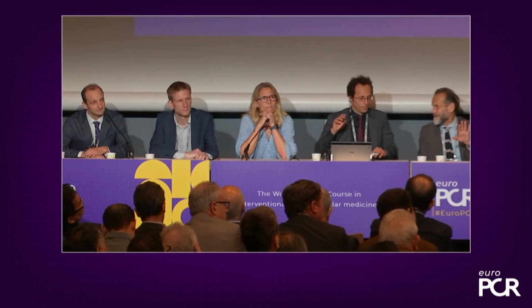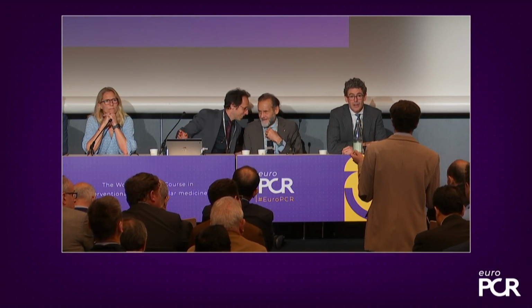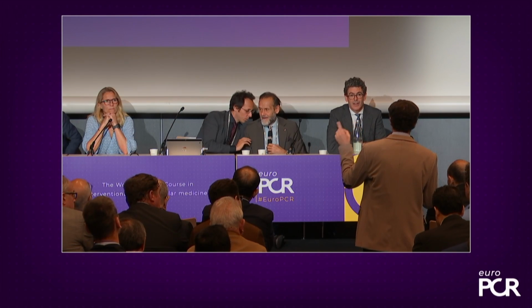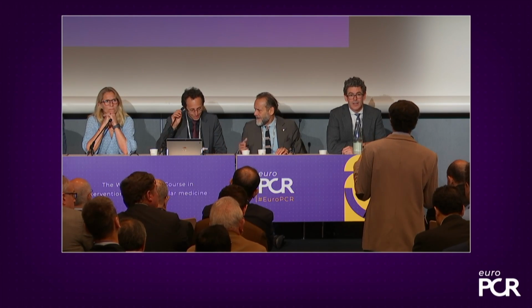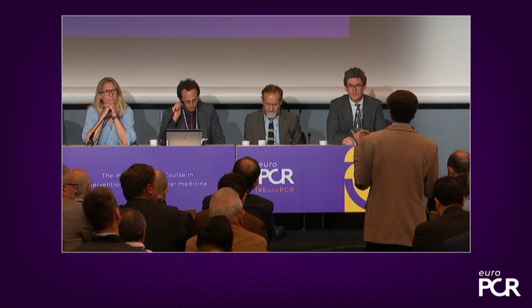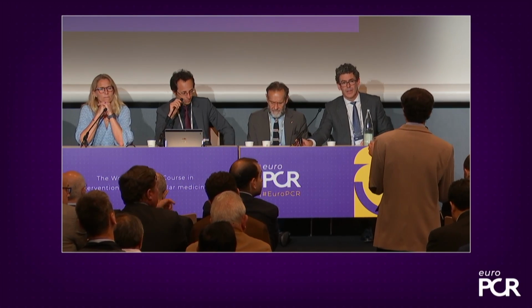Thank you. Great presentation, Dr. Jonathan. I have seen a similar case with a lesion in the ostial CX 1 year ago in the Netherlands. Full compliant balloon expansion led the operator to implant a stent directly from the left main to the LCX. And then we were faced with a recoil issue involving the ostium of the CX again and again, and nothing worked, even using the non-compliant balloon, using the OPN, and even using the shockwave in that area.